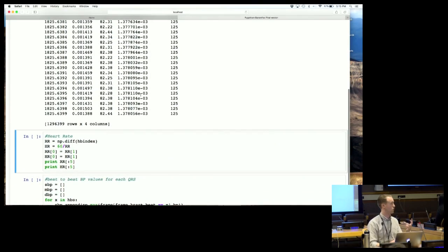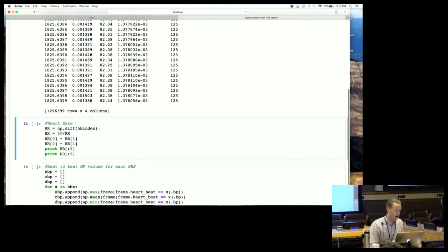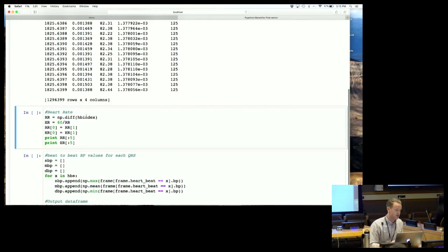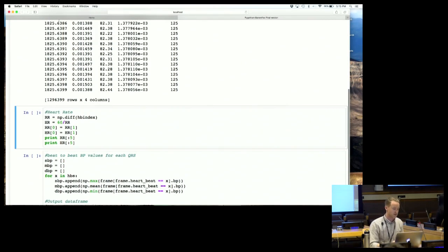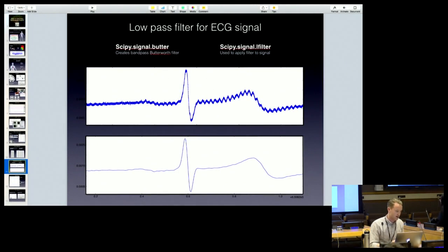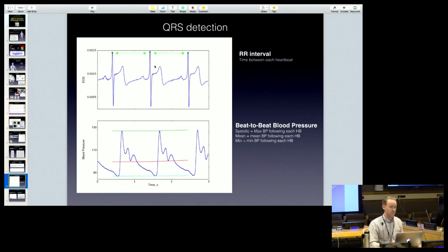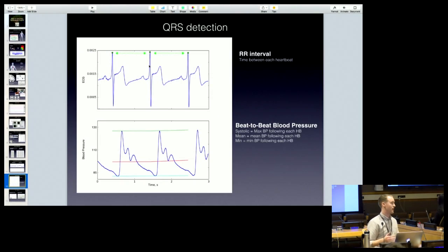Heart rate is calculated as 60 divided by the RR interval, which is the difference in time between each consecutive QRS peak. You can see that right here - we're calculating just the time between each heartbeat.